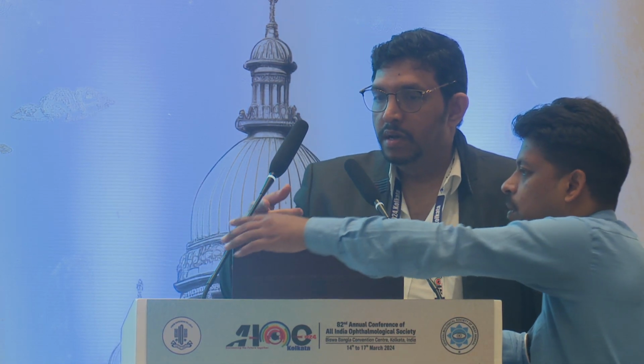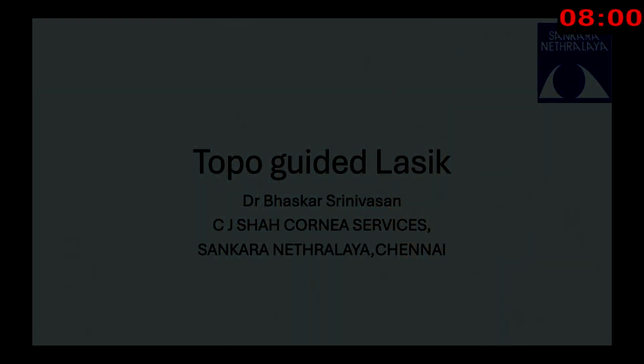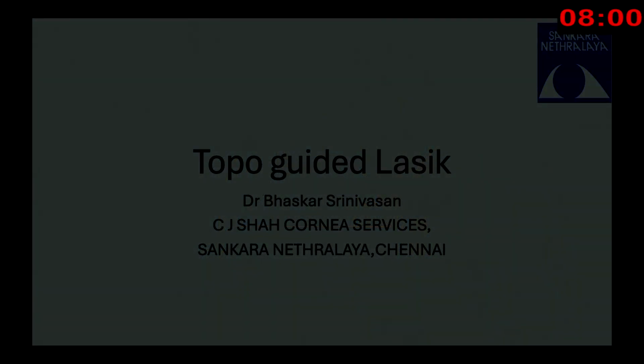PRK, I do up to -6 diopters. But there are a few of my friends doing up to -10 also. I think Dr. Vinod would agree with that. Again, how you use this mitomycin C, the time calculation, then I think you can do. Again, it depends upon the patient to patient and a lot of other factors involved in refractive surgery. So the pre-op workup is so important.